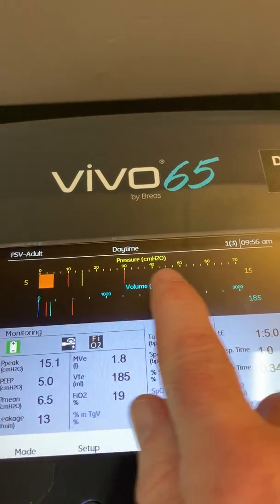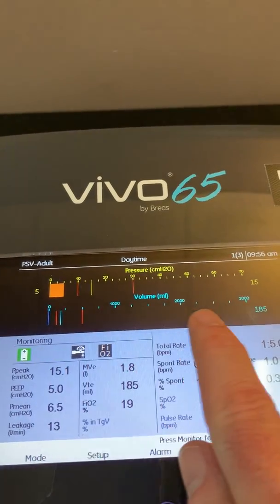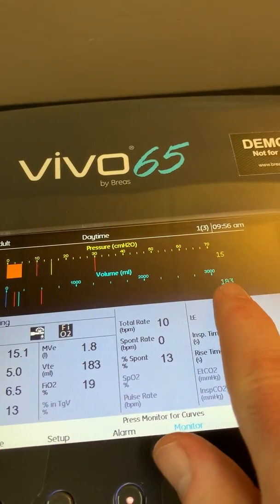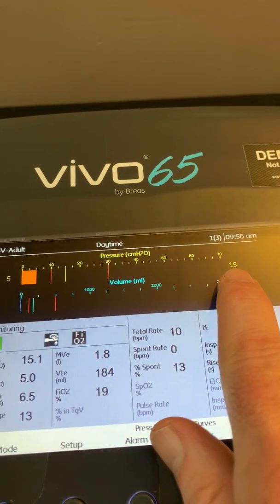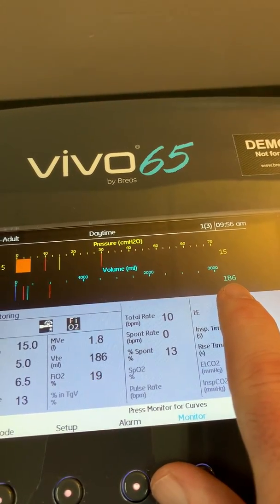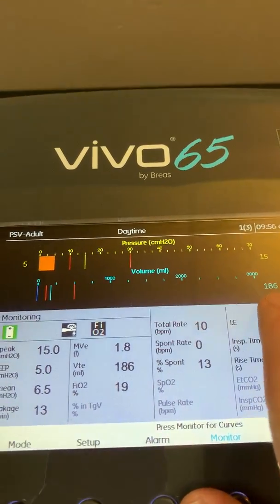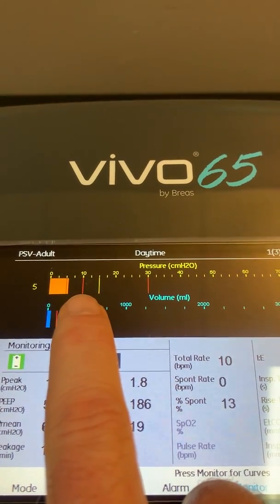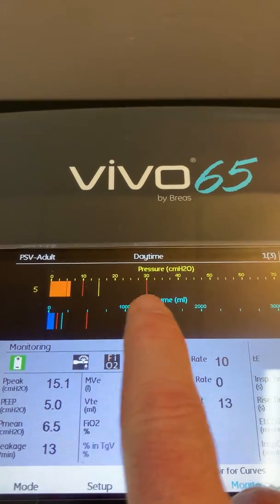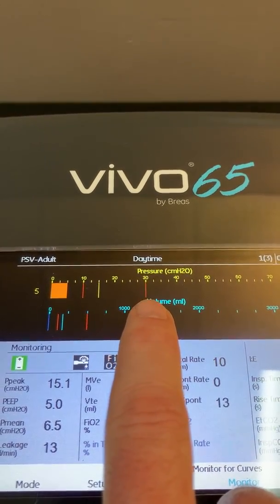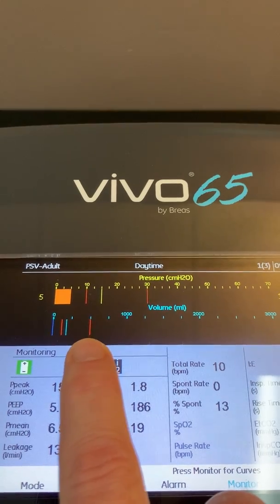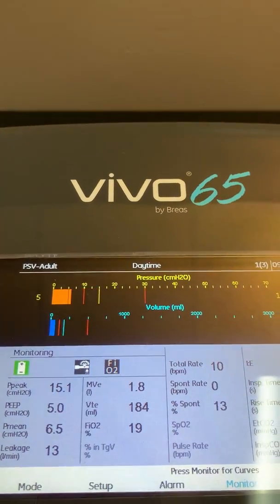There's a real-time graphic display of pressure as well as a real-time graphic display of tidal volume. Those values are displayed here: peak pressure, end expiratory pressure, and tidal volume delivery. There are red lines representing the low pressure alarm setting and the high pressure alarm setting — currently set at 10 and 30 — as well as a low and high tidal volume alarm setting.